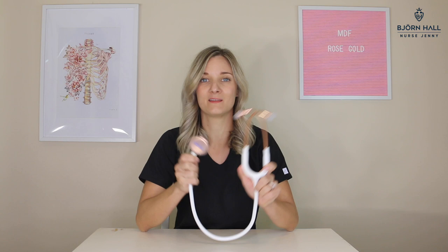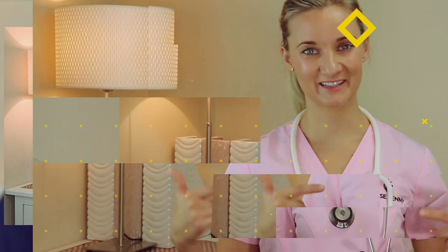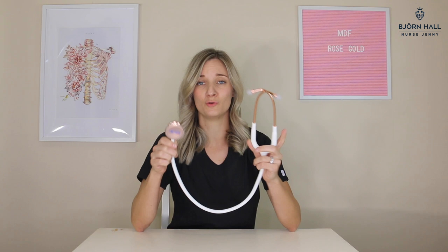Hey, what's up guys? Nurse Jenny here. I'm going to tell you all about the MDF Rose Gold stethoscope. Now I know that I'm not the first person to talk about this Rose Gold MDF stethoscope, and I'm certainly not going to be the last. This is a beautiful stethoscope. Anything that sort of glitters will catch my attention — I love the rose gold feature of it.